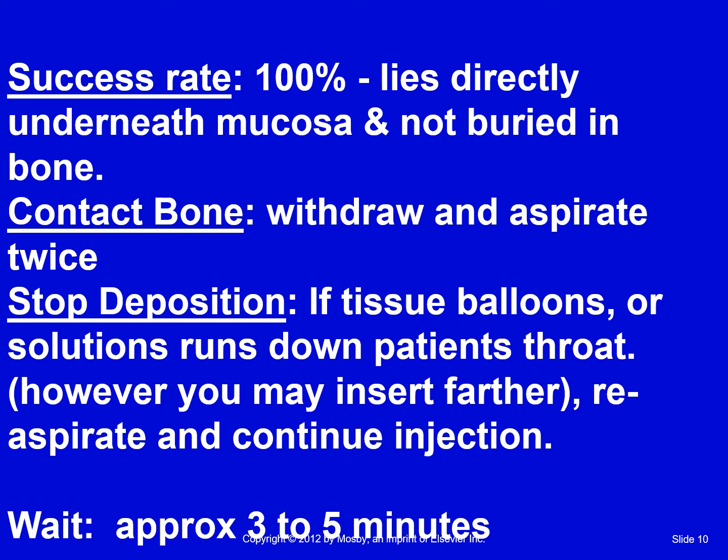That nerve lies directly underneath the mucosa. It is not buried in bone. It's really almost impossible not to make this nerve have complete anesthesia. So you contact the bone, you withdraw just a bit, aspirate twice.